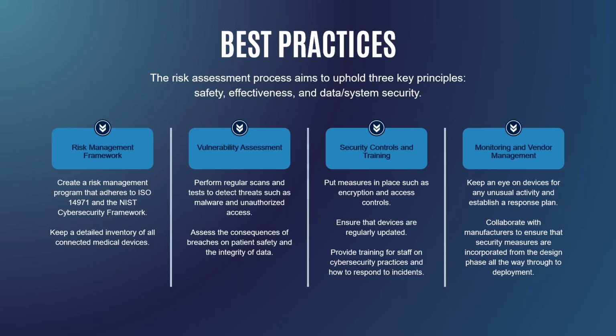that inventory of connected medical devices, whether or not you use an IoMT or other inventory storage system, having that available. Performing those vulnerability assessments, so conducting regular scans, whether active or passive, for malware threats and unauthorized access, and evaluating the impact of breaches on patient safety and data integrity.